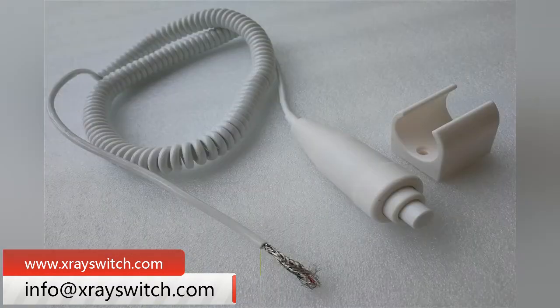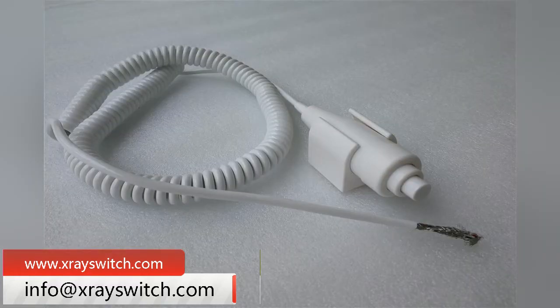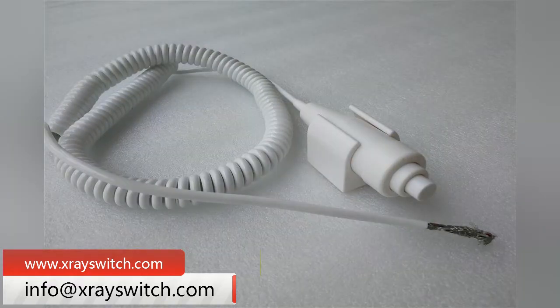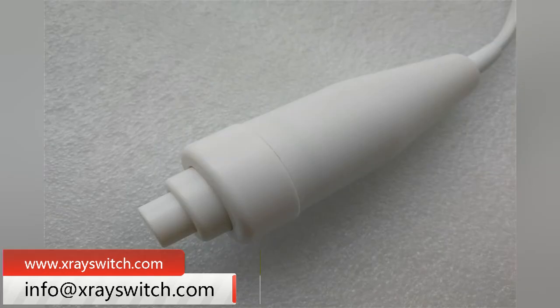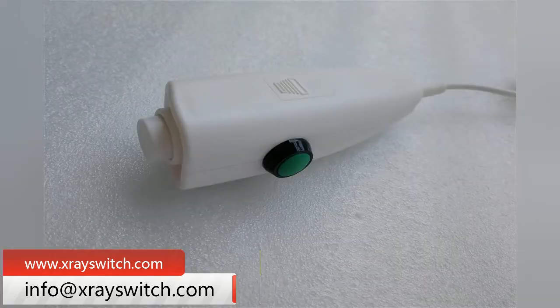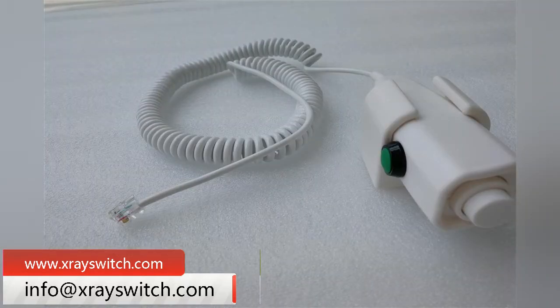The x-ray hand switch with Omron micro switch has longer service life and higher sensitivity. The use of Omron micro switch as component contact means the x-ray hand switch will not cause oxidation. The pure copper wire with 0.2 square core will not affect the x-ray hand switch when the current is larger.